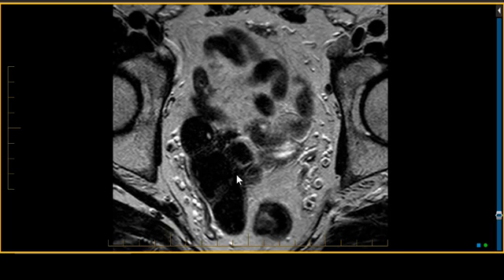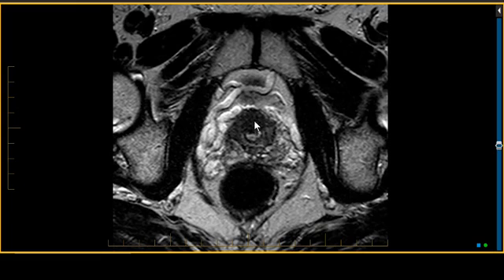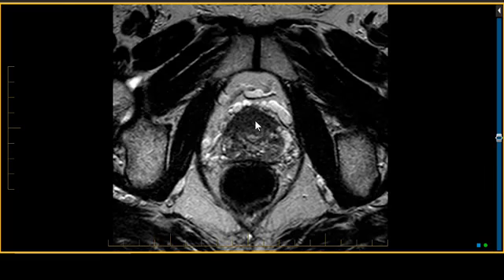So this case is illustrative of 2, perhaps 3 key teaching points. 1, that anteroapical lesions can blend in with the anterior fibromuscular stroma and easily get missed on imaging. As a subset of that, 2, biopsying the gland from the back may not make it easy for the surgeon to access this very far anterior tumor. And 3, when you're T-staging these lesions, evaluate the capsule on both sides, and do not forget to evaluate the skeleton and the other associated accessory structures in the neighborhood, like the seminal vesicles, like the capsule, like the regional lymph nodes, which were positive in this patient.